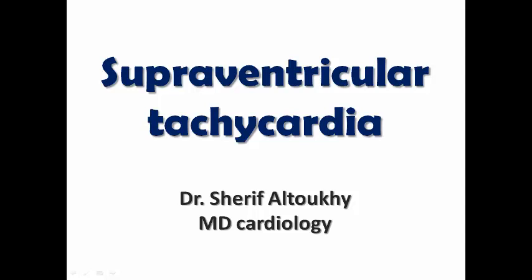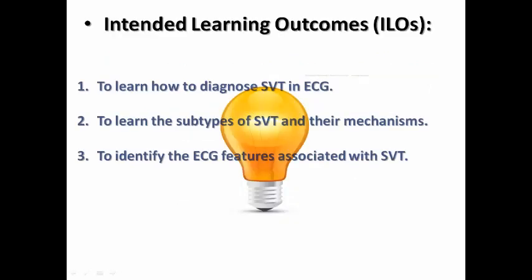Hello everyone and welcome to this lecture, which is about supraventricular tachycardia. This is the start of dedicated lectures for each type of tachyarrhythmia, and today we are starting with SVT.